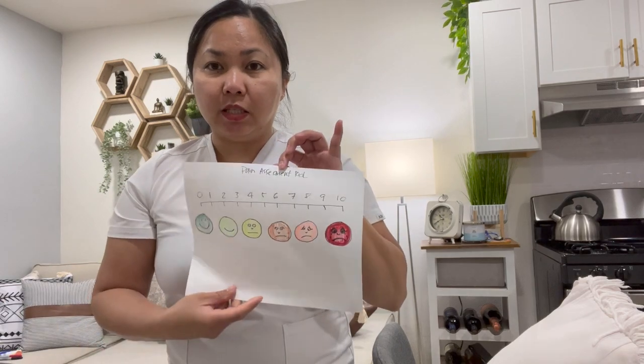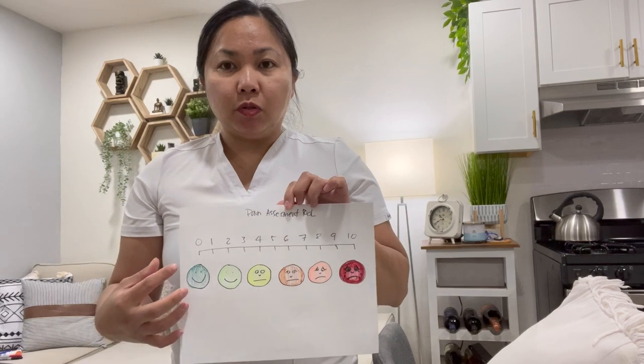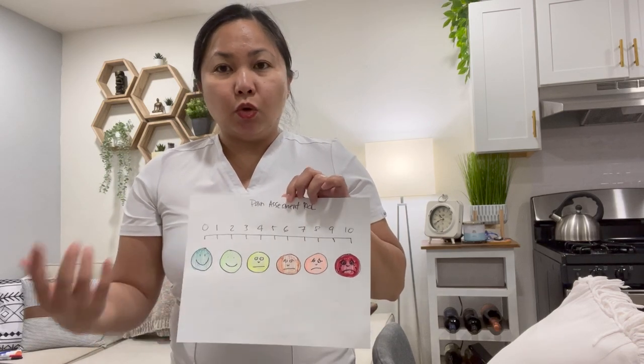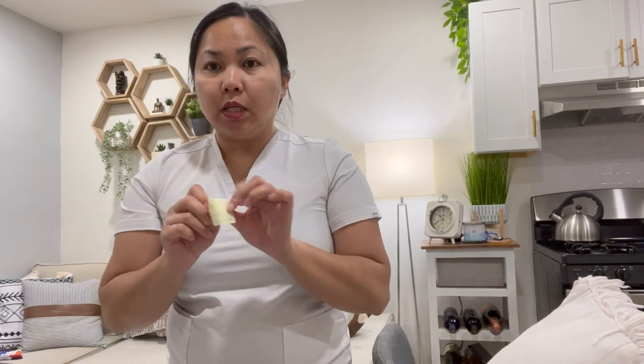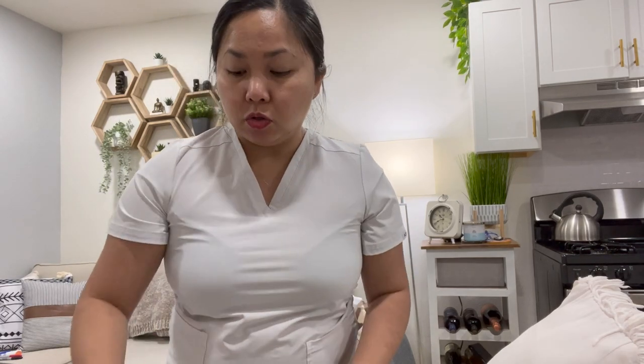And then your pain assessment tool — usually the facility also provides this. There's a pain level scale here. You could check with your patient what their pain level is. Zero means no pain and 10 means excruciating pain. Show this to them and let them point to it so you can assess their pain. And then some labels for your epidural infusion line — you just tape those on the lines for your infusion.